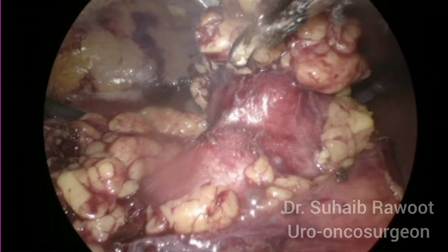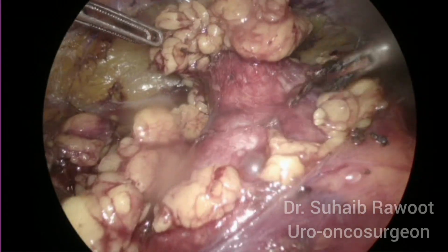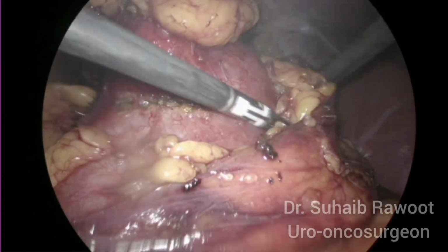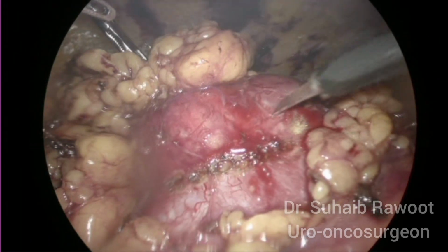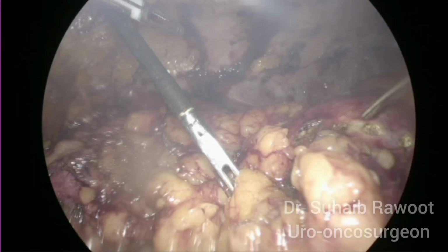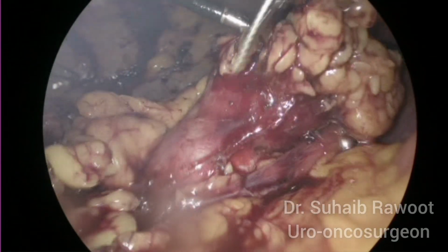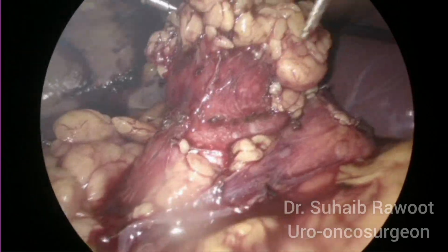Dissection of fat is now complete. Now we are marking the tumor boundary with cautery. Tumor marking is complete.